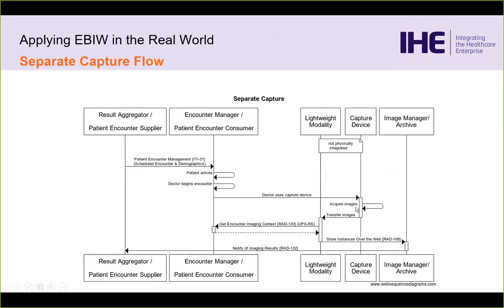So Dr. Roth described a lot of urgent emergency room cases where the first thing is get the image and get the patient moving on their way. And then you may circle back and say, okay, now we're going to upload this thing. Oh, let's do a quick query. Here's their emergency room ID. And so the image capture can happen first, the query can happen second, and then they can go get stored off to the archive.